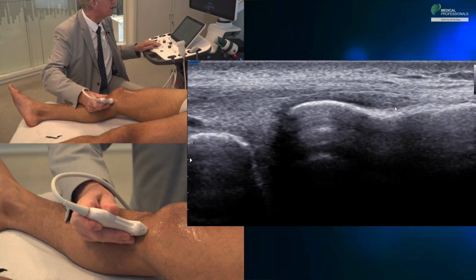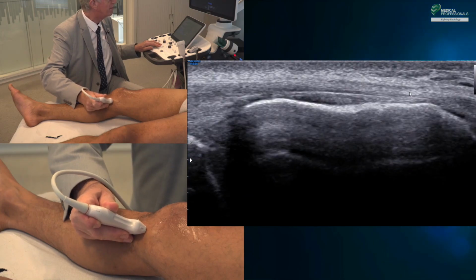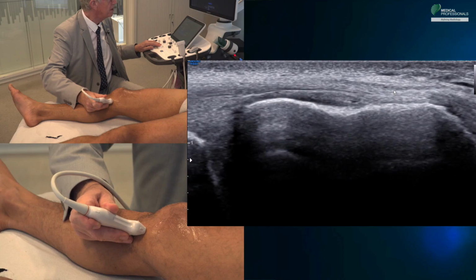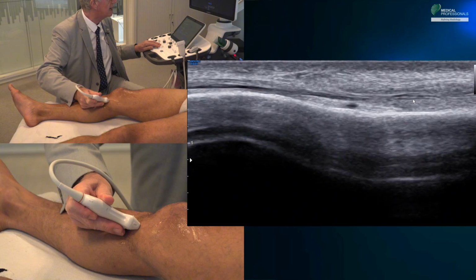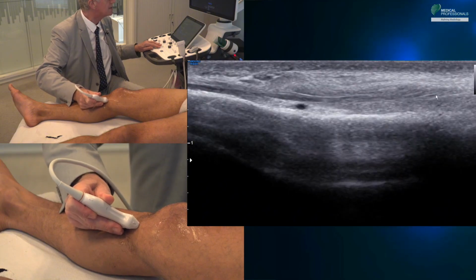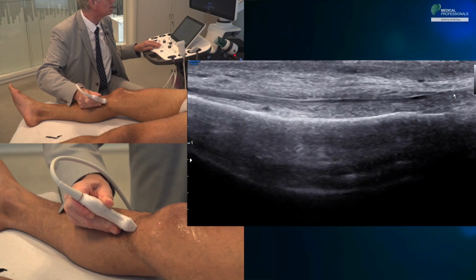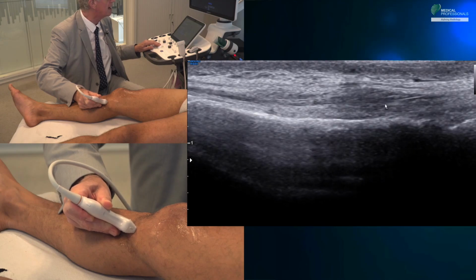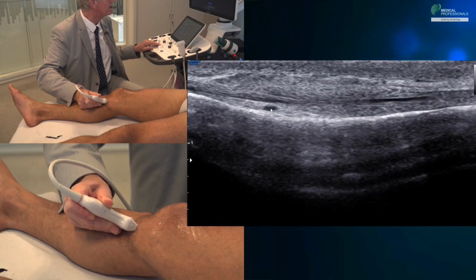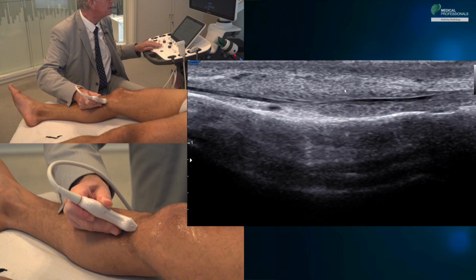We have the meniscotibial bundle that inserts very quickly. The superficial bundle, on the other hand, has a proximal insertion and also a much more distal insertion, which is under the tibial plateau. We see the ligament fibers really go down under the metaphysis. We have on this section, in depth, the geniculate vessels that are crossed by the distal part of the medial collateral ligament, and on the surface there are the tendons of the pes anserinus.